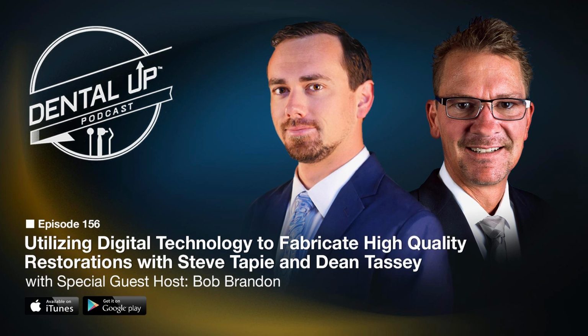We get some 3M. We have a couple doctors that are having very good results with 3M. The scanner is a little bit older, but the 3D model that it produces is still up to par. I'd say that the biggest disadvantage to 3M, however, is that it does require a spray. You have to spray the prep site. Are we currently making our models here for iTero and 3M scans? Yes, we are. We're making all our models here with the carbon printer that we have.